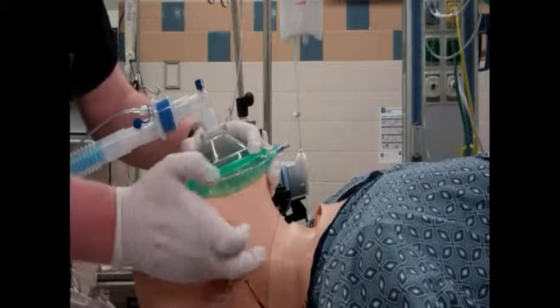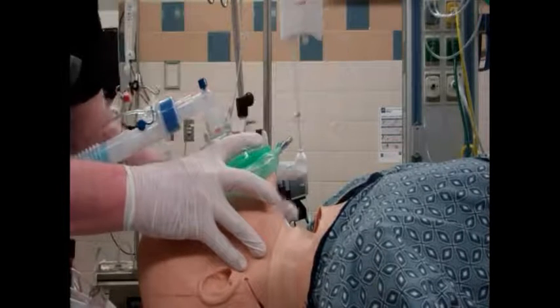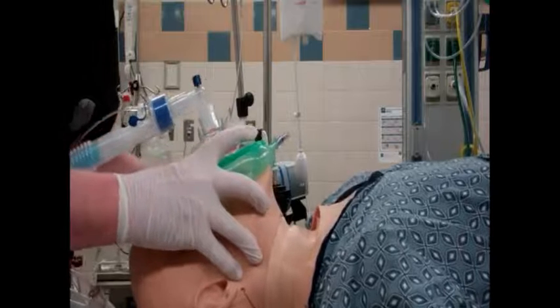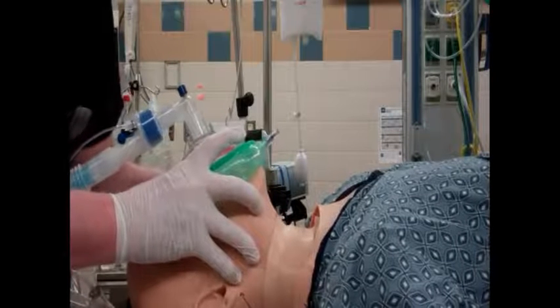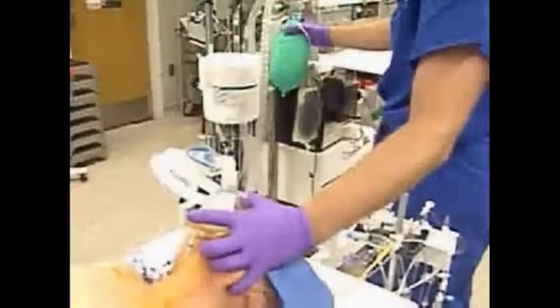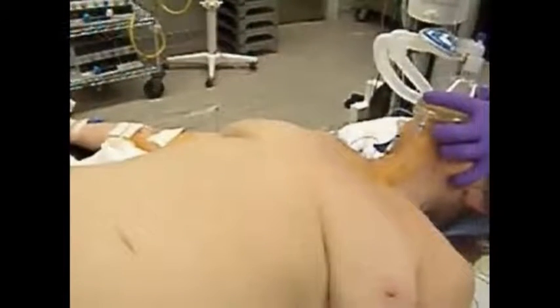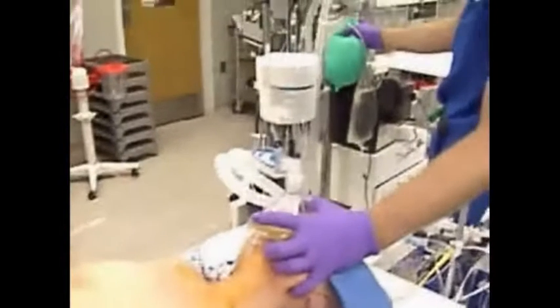The downward pressure must be enough to form a pneumatic seal so that there are no leaks, but not so much as to occlude the airway. This would defeat the purpose of what we're doing. Here is an example of this technique being used in the operating room. I like to consider that the left hand is holding the airway open while the right hand is breathing for the patient.